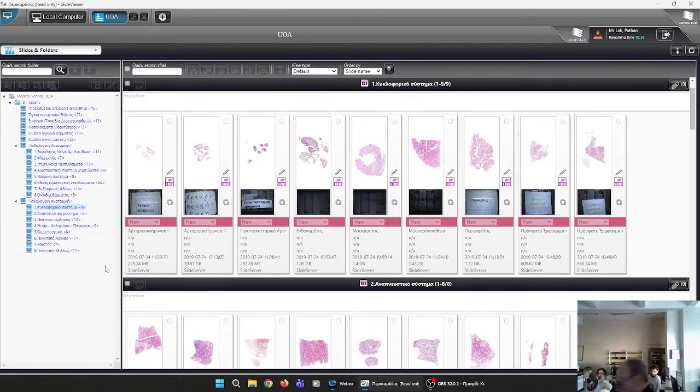Yes, please. For the slide you did on the hypertrophic myocardiopathy, would we not see atypical? It's not one of my favorites because I'm not sure about the disorientation of the fibers. I cannot understand that very clearly. So I won't ask it. I think I won't ask this slide. It's been described in the literature. However, I'm not sure because you must always have what the normal is to understand the disarray of the myocardial. And I'm not so strong on circulatory pathology, on heart pathology. So I don't think I'll ask this slide.